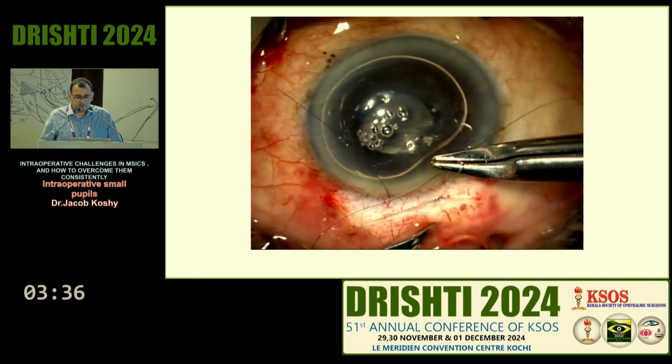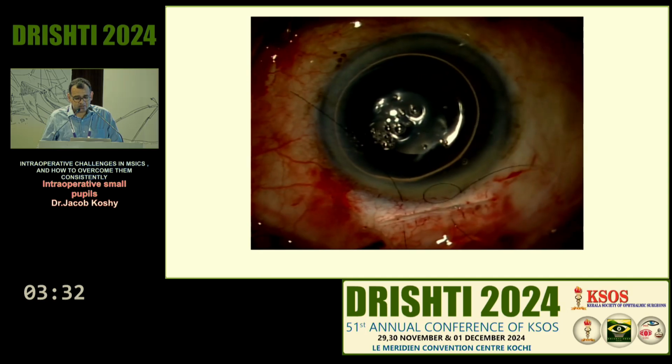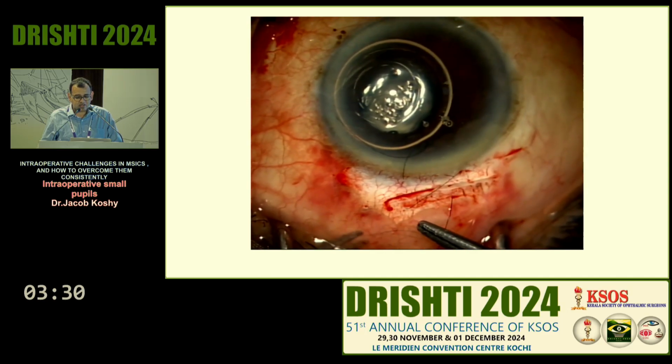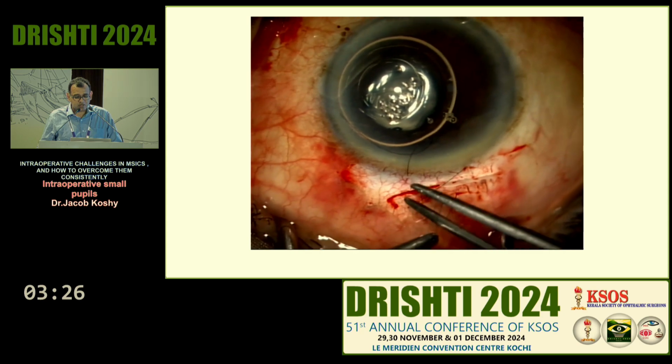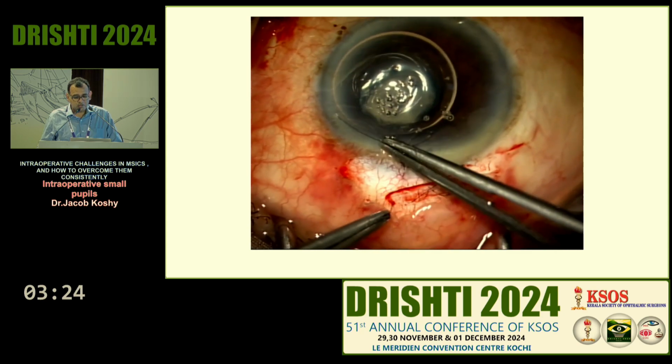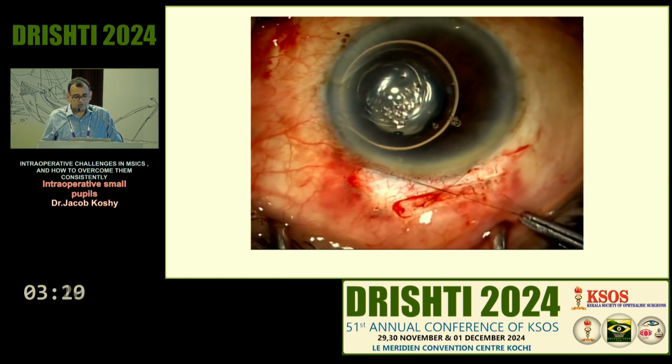You can put a Fine's infinity suture if you know how to do that or you're comfortable with that. I usually put this cross suture. It hardly causes any astigmatism. It's just one single cross suture across the breadth of the wound. And you make sure that your wound is absolutely watertight.